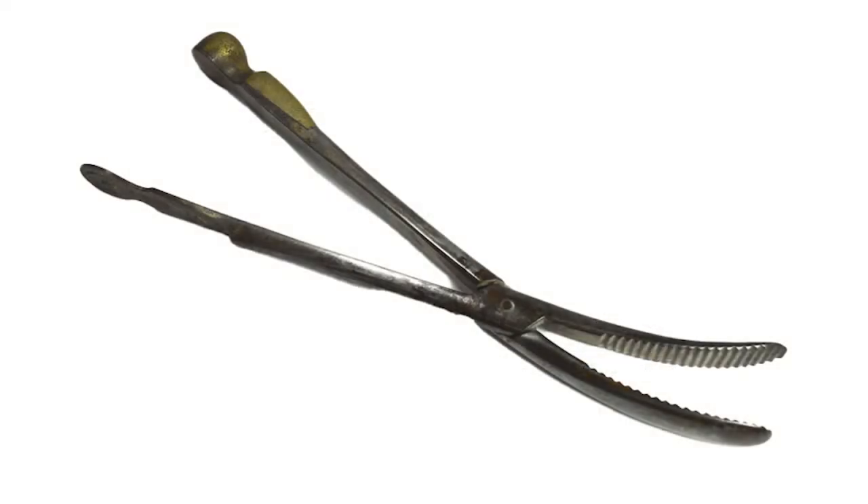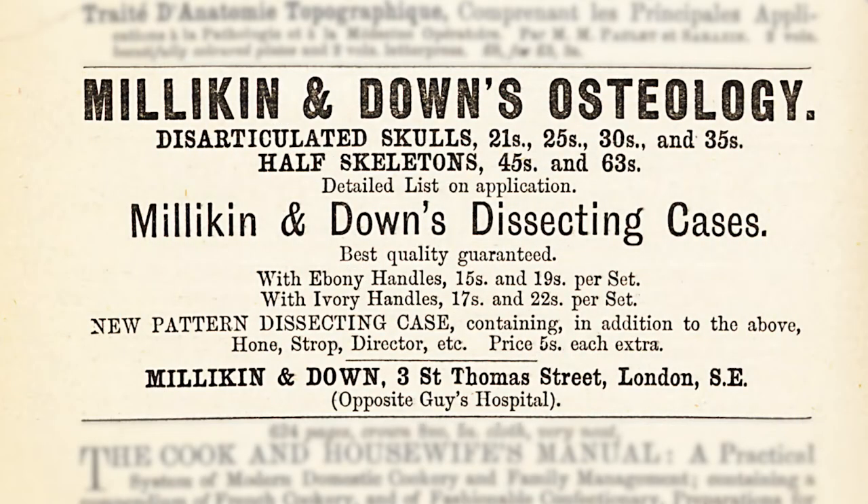The Cranioclast on display was made during the 1880s and probably used in the decades after, when caesarean sections were not widely available because of the high mortality rate following surgeries. It was likely supplied by John Millican Jr., who ran a surgical instruments shop on St. Thomas's Street.